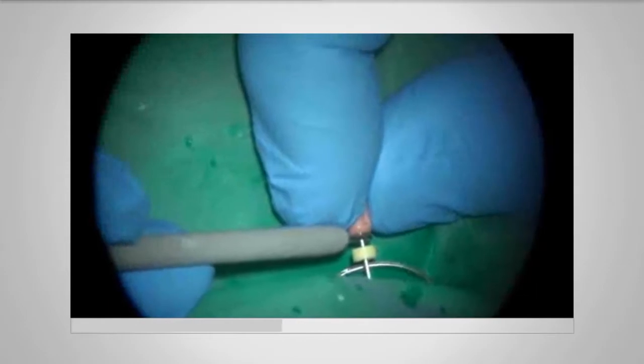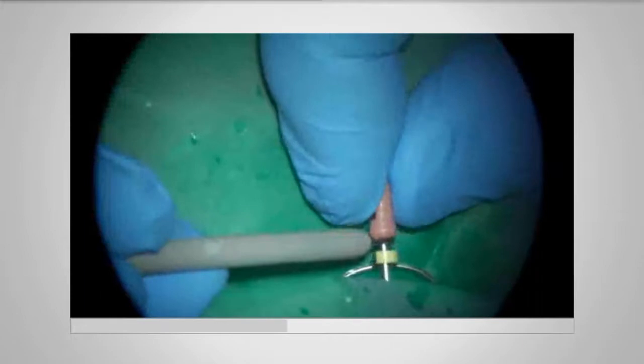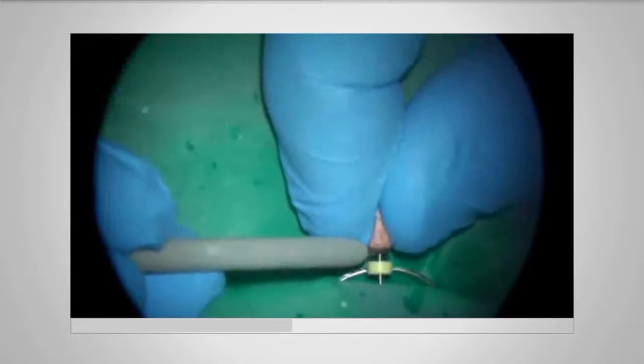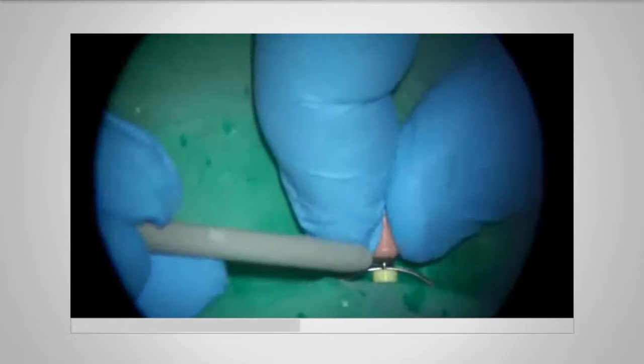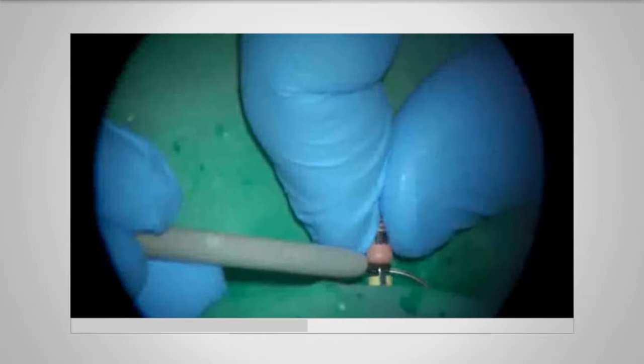I'm going to gently advance the file here with the apex locator lead attached until I get to the full working length. And I use a watch winding motion with gentle, small vertical increments just to make sure I don't block. And there we are, we're down to the full working length.